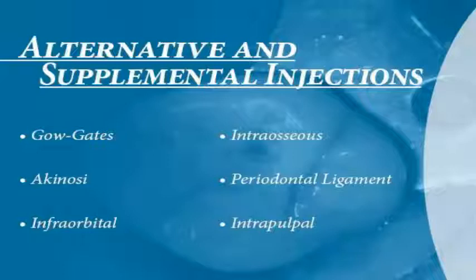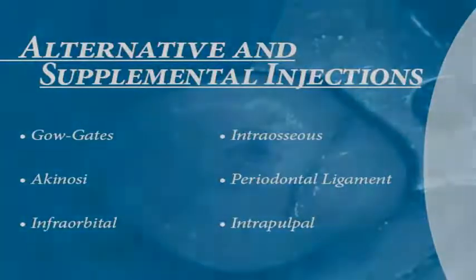Although routine anesthetic techniques are usually effective for treatment of most pulpally involved teeth, some endodontic procedures present special situations that require additional techniques and special approaches. In these videos, you're going to observe how to administer alternative and supplemental injections in patients with pulpal and periapical diseases.